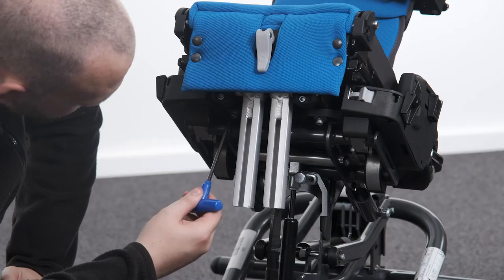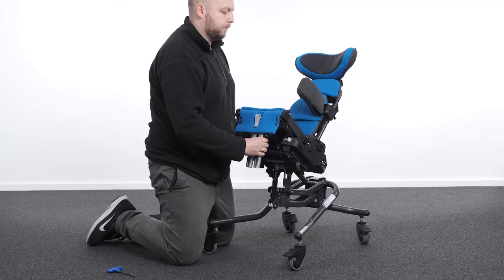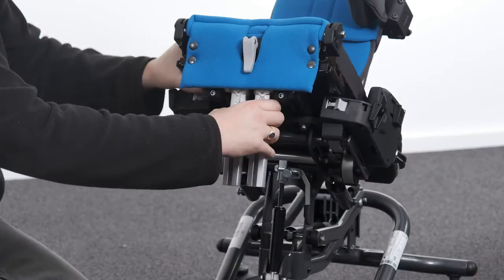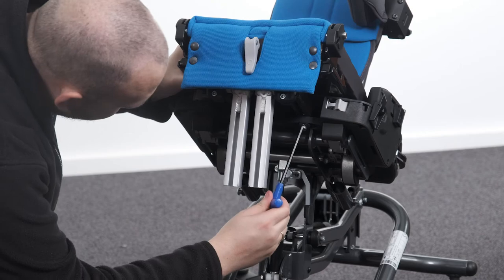Adjusting seat depth on the basic seat. To adjust the seat depth on the basic seat, loosen the left and right bolts on the underside of the seat base and move forward and backward to a suitable position. Tighten both bolts to secure in place.